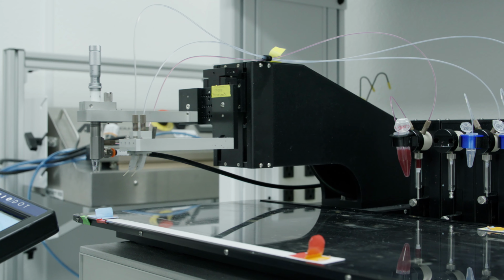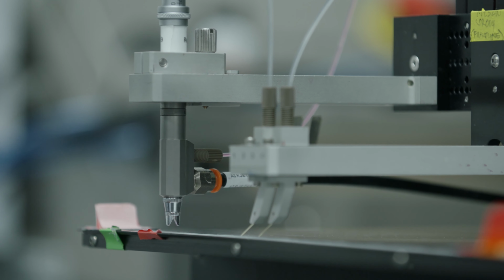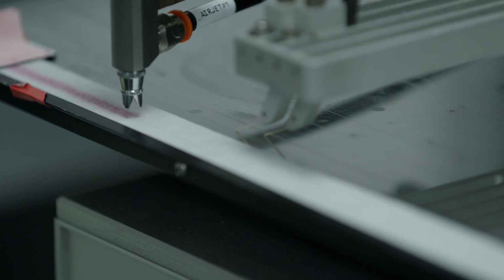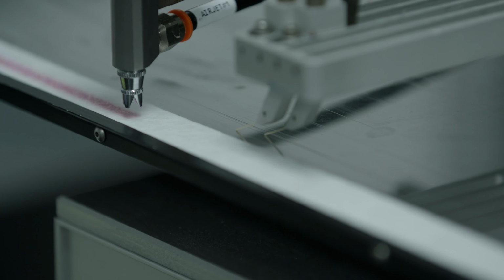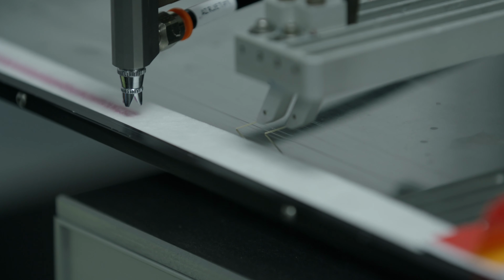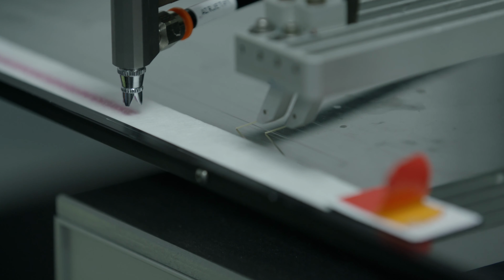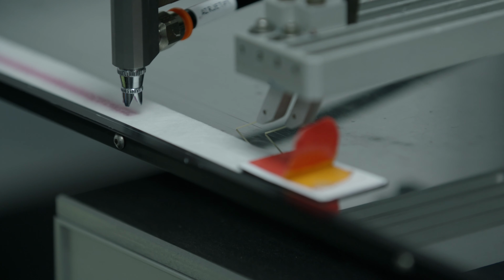This allows us to keep reagent dry down onto a material and allows lateral flow to be run in various different conditions and places. In traditional laboratory tests, you would need to use a pipette in order to use this reagent. But with lateral flow, we can dry it onto this pad, and then now anybody with a plastic transfer pipette or a dropper bottle can run this test.